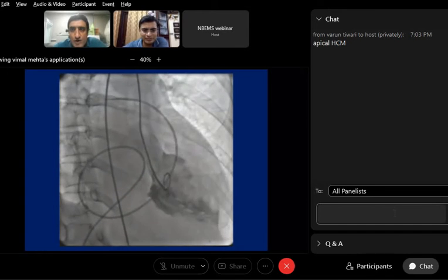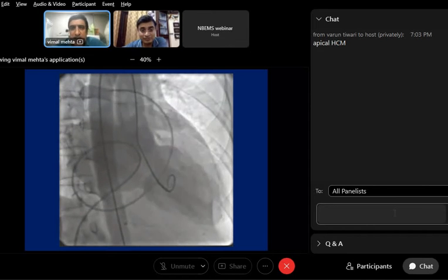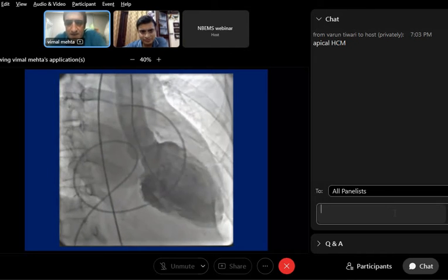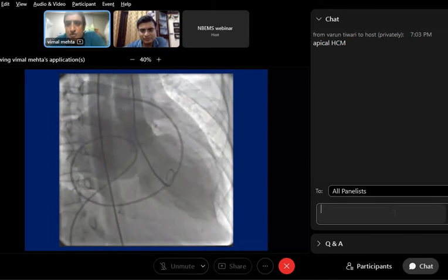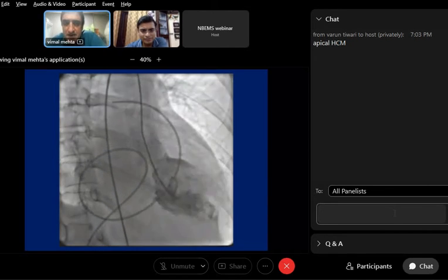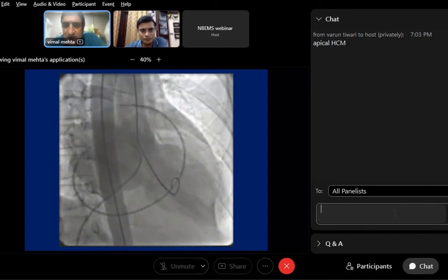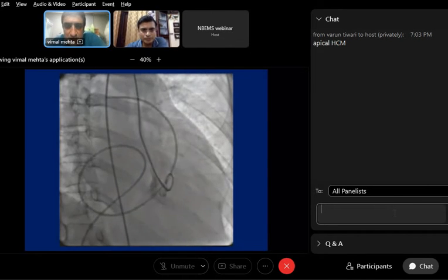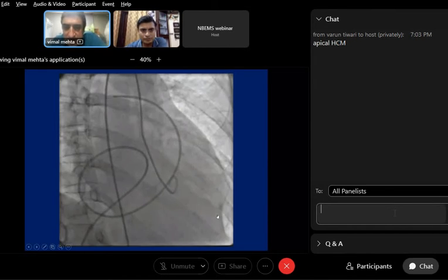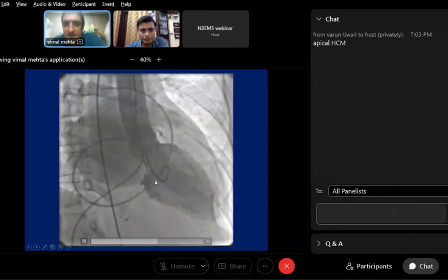RO view, okay, at least people are clear about the views. Catheter in the MPA, very, very good. I am impressed. One catheter is there in the MPA. So, severe MR. Somebody has put a catheter in the main pulmonary artery, so they want to measure this thing. So the patient must be in relatively bad shape for some reason or the other. But the LV looks relatively okay, except perhaps some doubtful basal hypokinesia. And there is severe MR.